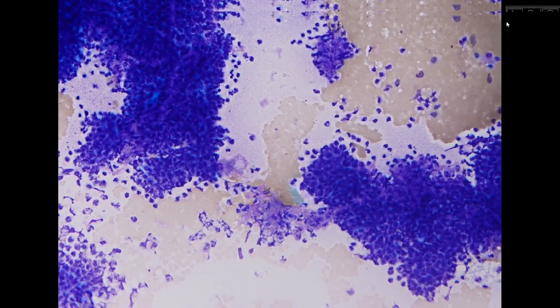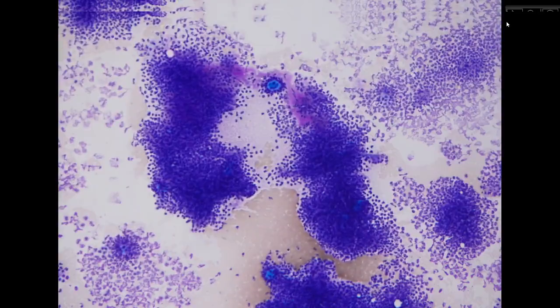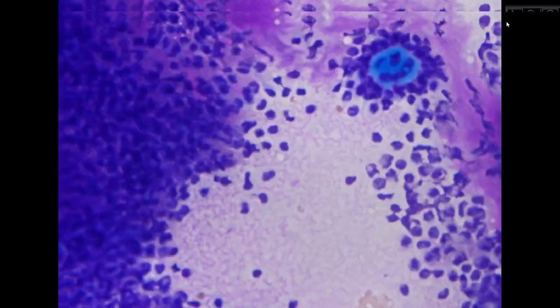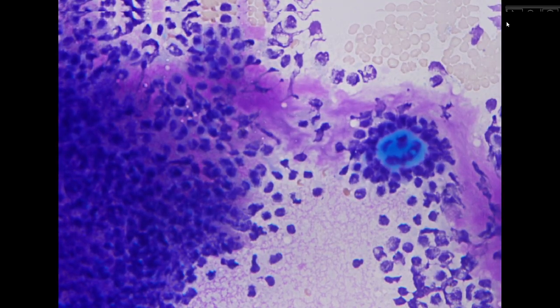The most important thing is that this material looks very fibrillary, so it has a very indistinct border. So fibrillary type of matrix is one of the most important clues for pleomorphic adenoma.